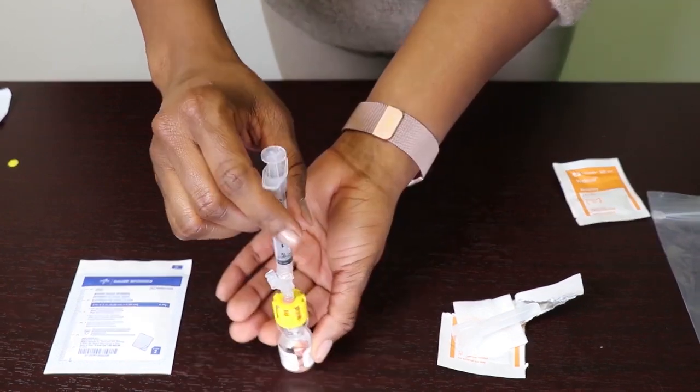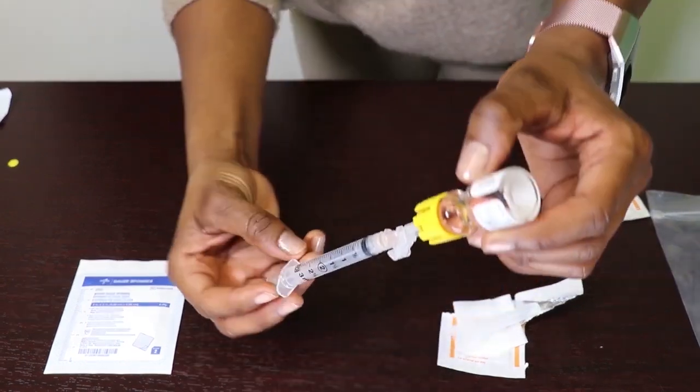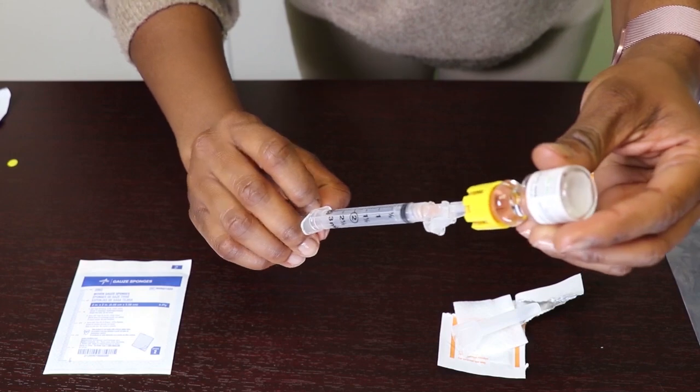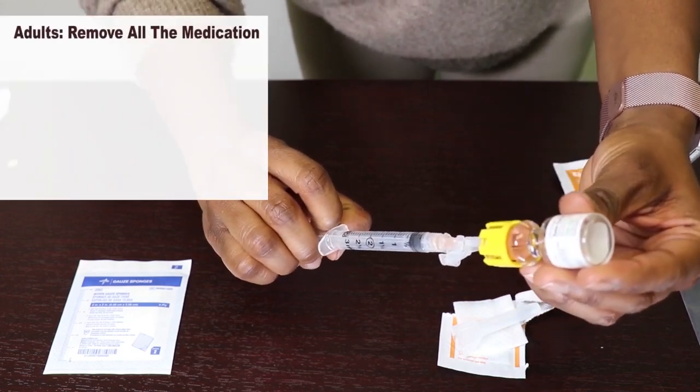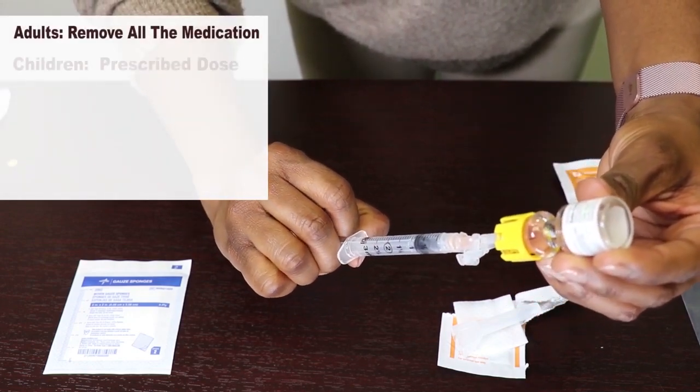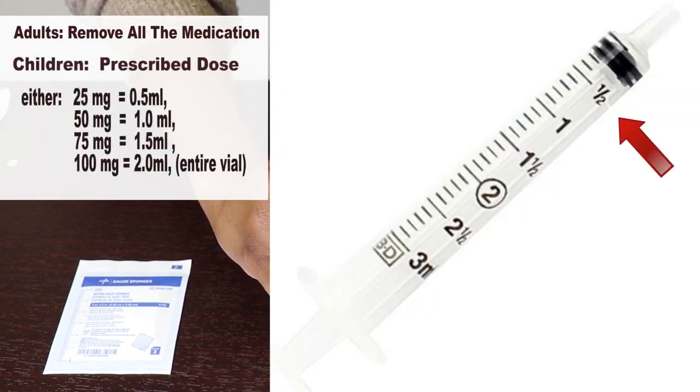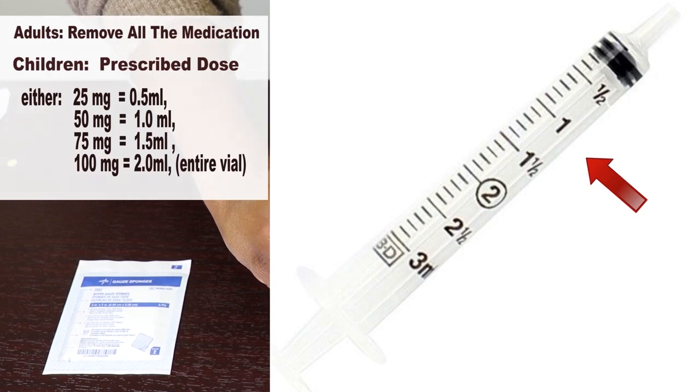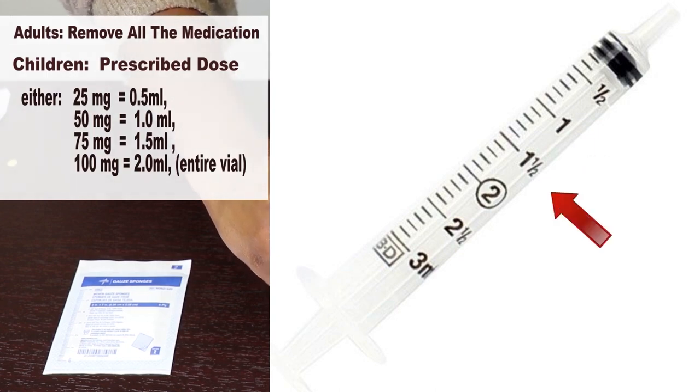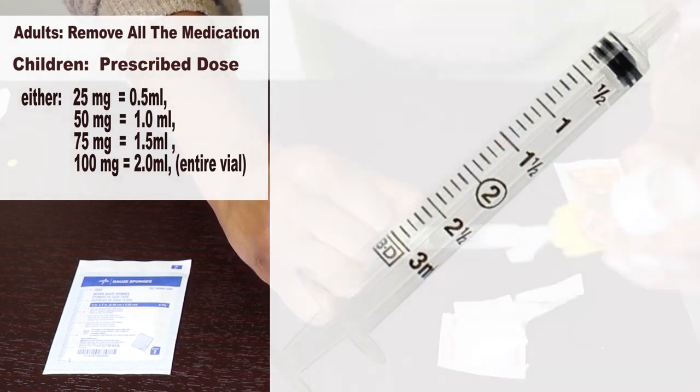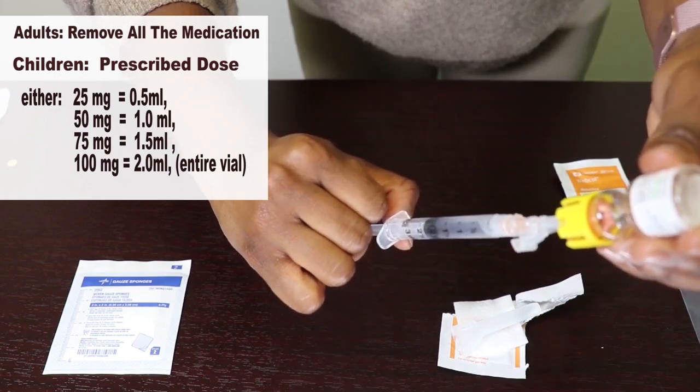Turn the vial upside down and gently pull back on the plunger to draw the medication into the syringe. For adults, you will remove all the medication in the vial. For children, your child's health care provider prescribed a dose either 0.5 mls 25 mg, 1 mL 50 mg, 1.5 mL 75 mg, or 2 mL 100 mg the entire vial.